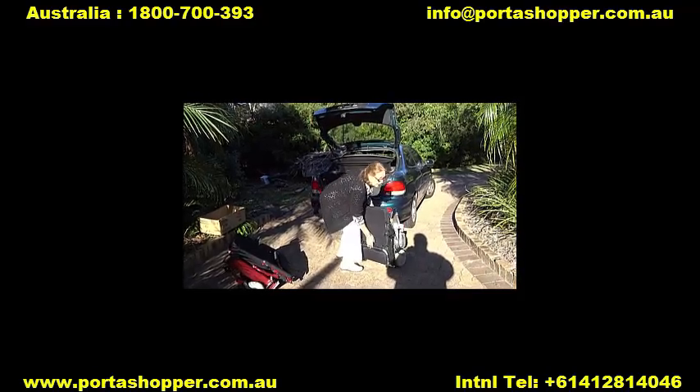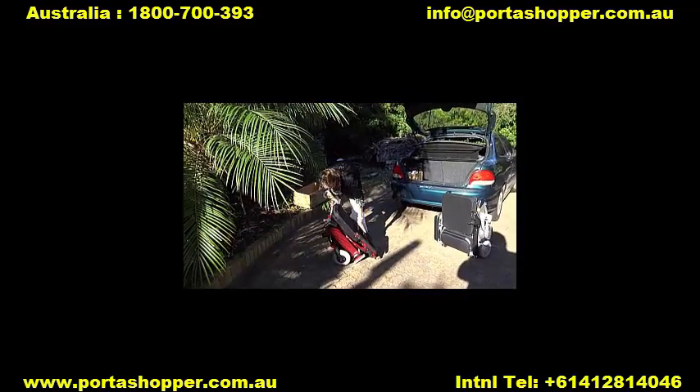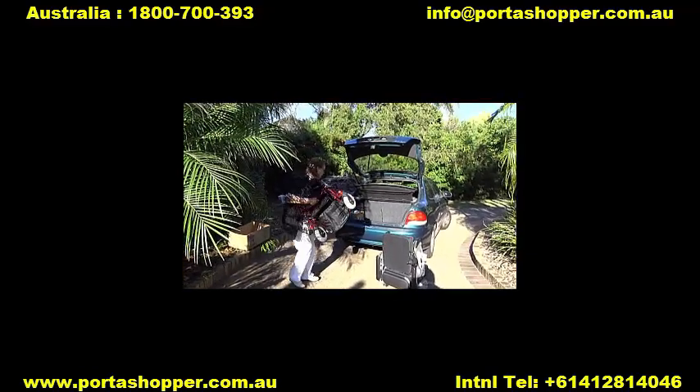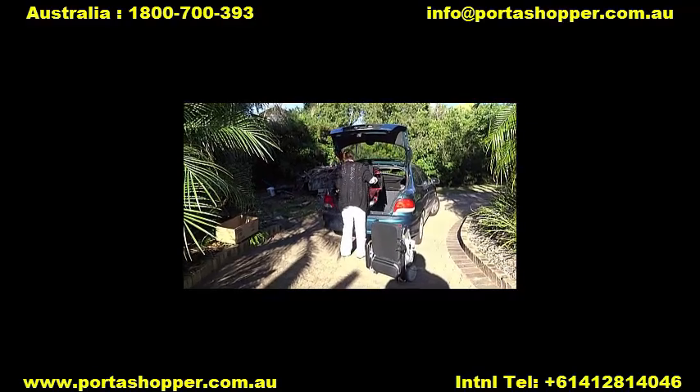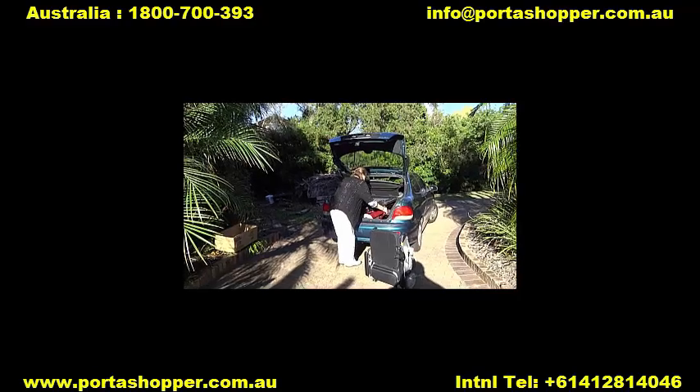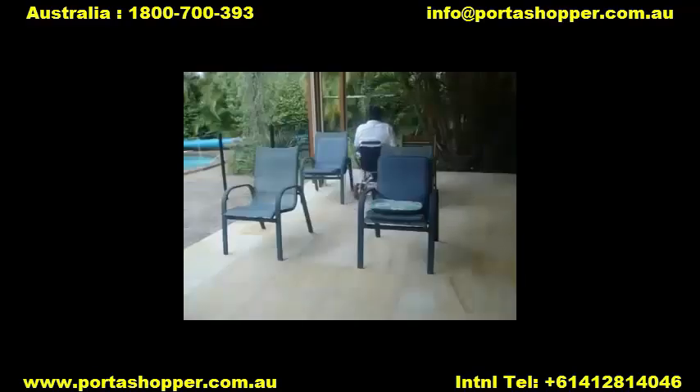The PortaShopper 2 is also compatible with almost all our optional accessories including the Big Easy Kit, the air glide suspension casters, our adjustable angle leg rests, standing sticks, the carer control arm, and the PortaRamp.